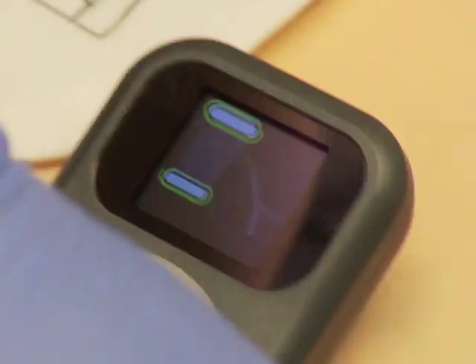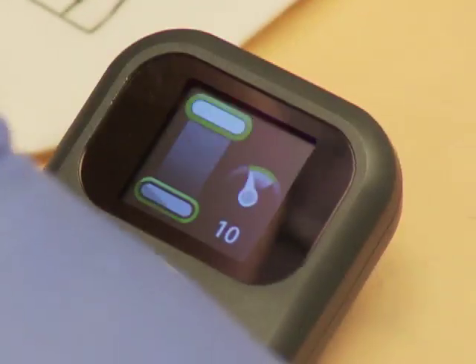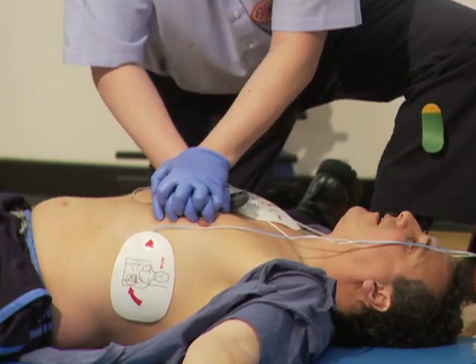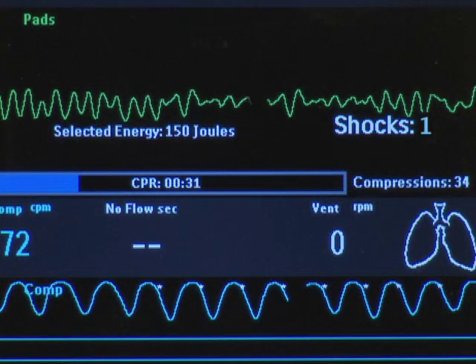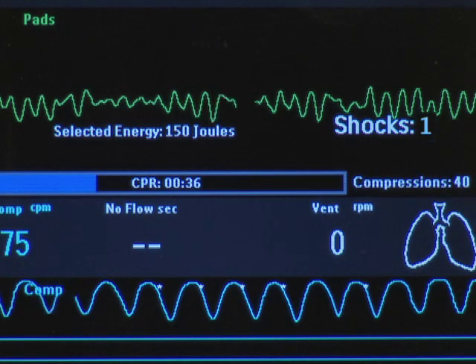As the chest is compressed, the meter's display provides information about rate and depth of compressions. When the speedometer needle points to the green area, this indicates that the compression rate is within the target range. If the needle is below or above the target area, this indicates that the compression rate is too low or too high, respectively. If the rate is not corrected to within the compression target rate, the MRX provides corrective voice prompts.